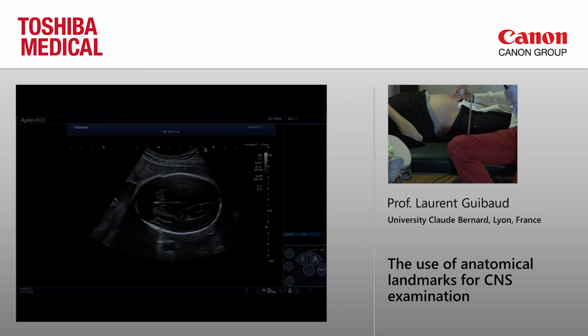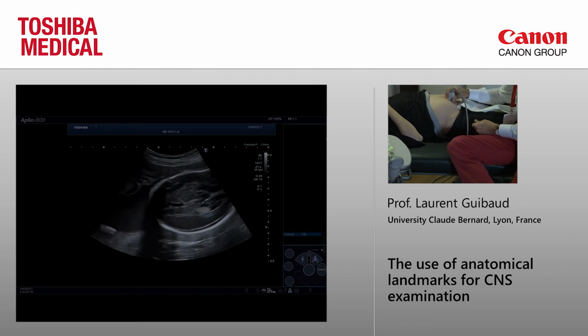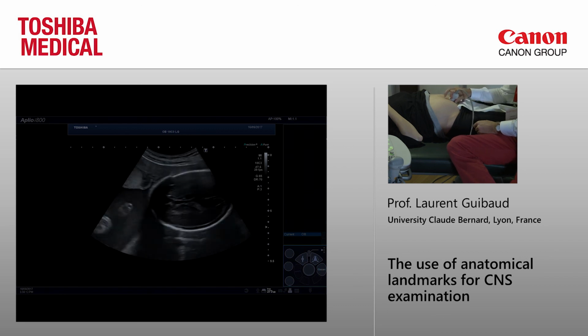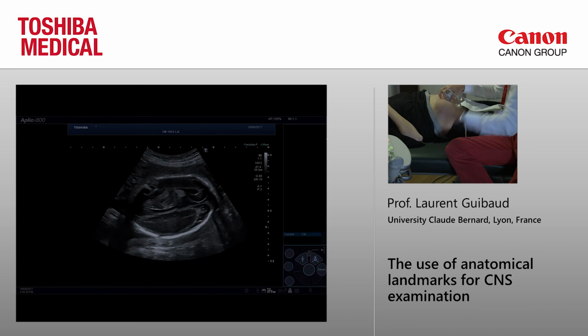You see that in that case, you don't see the proximal hemisphere. Sometimes it can be useful to see this hemisphere. And you can do this. I will try to do that for you. Okay, here you see the hemisphere. So this can be interesting. You see, you are completely oblique.